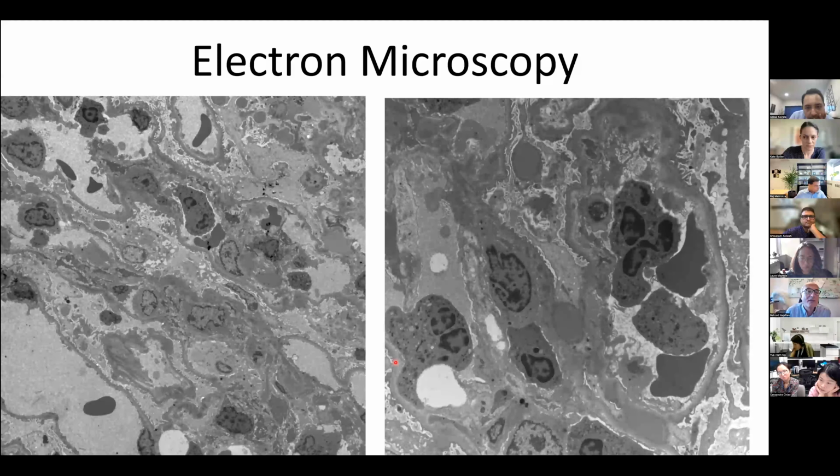So now let's move to the electron microscopy, and you already saw the more normal looking structure of the glomerulus by electron microscopy. On low magnification here, again, you can recognize the capillary loops, you can see the red blood cells, you can see those neutrophils, leukocytes. Here you see the bilobed nucleus on a plane within the glomerular capillaries.